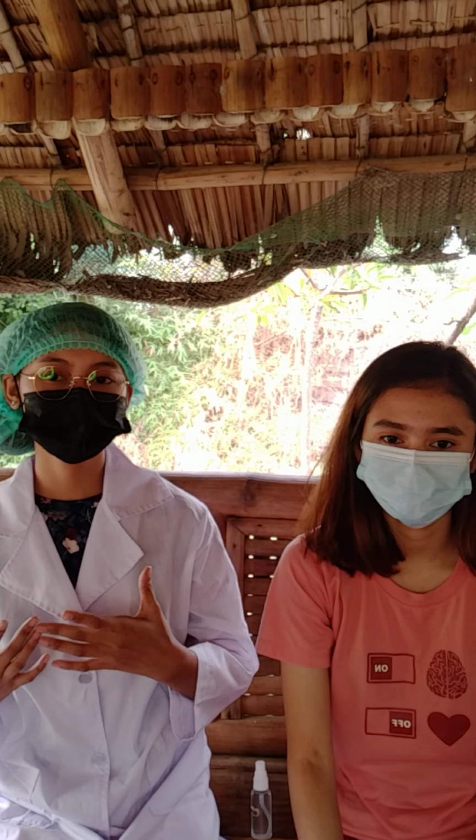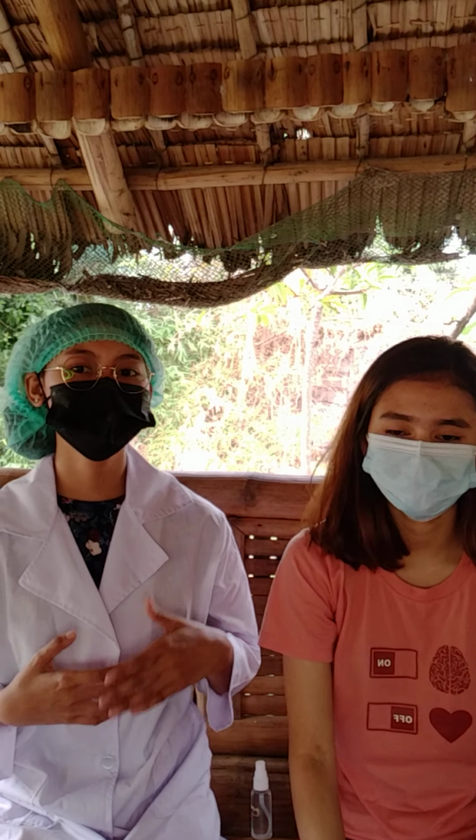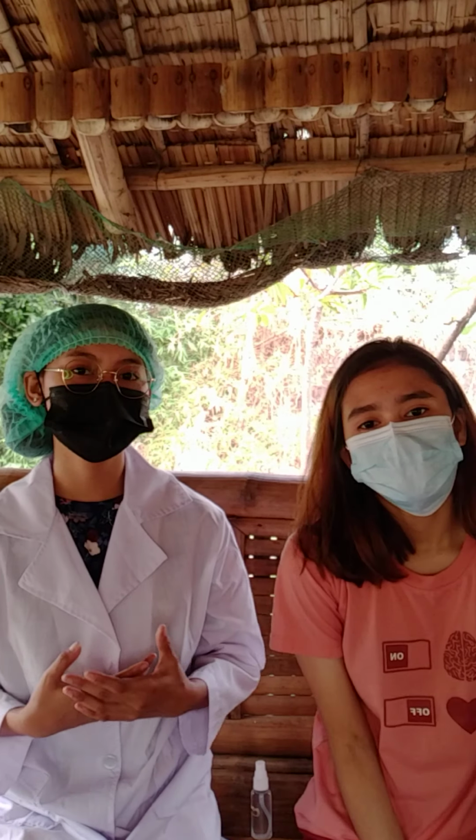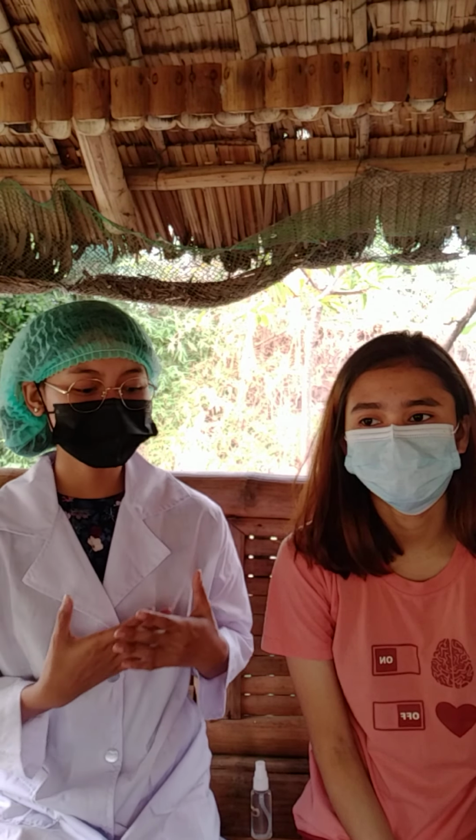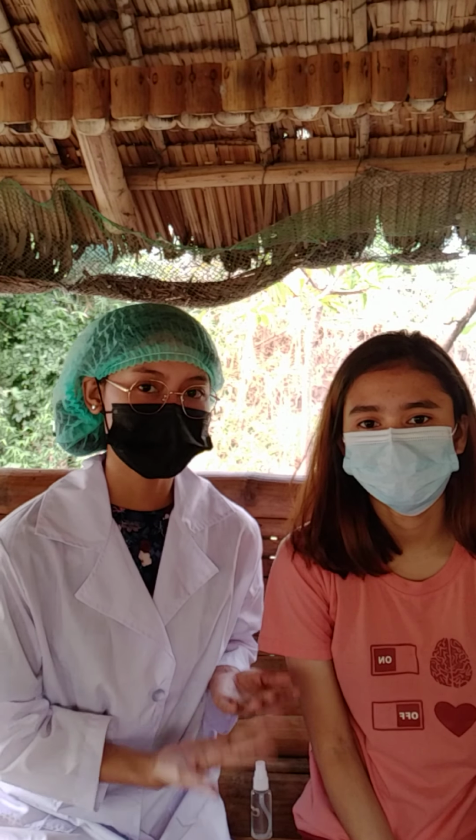If any of those conditions are present, do not use the affected arm to monitor the blood pressure of your patient.